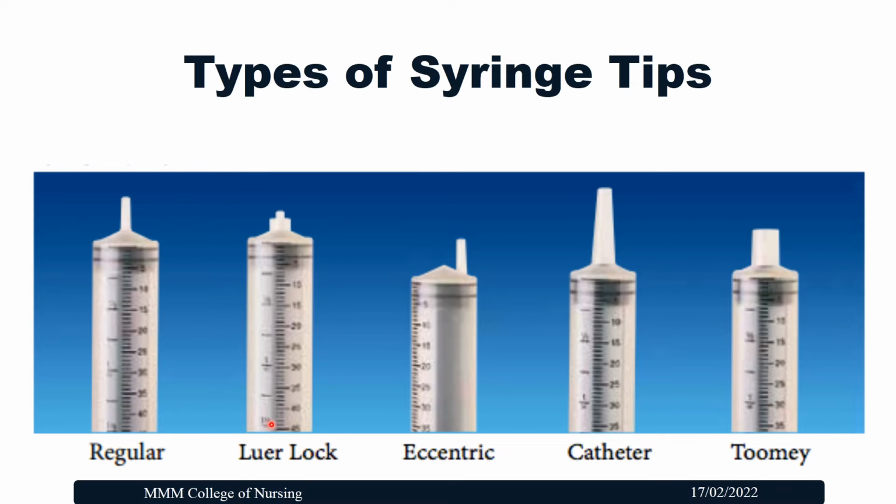The next one is the Luer lock. Here there is a screw type tip so that the needles can be fixed firmly and easily. It will not come out during the injection procedure.